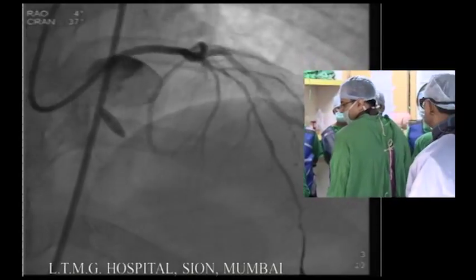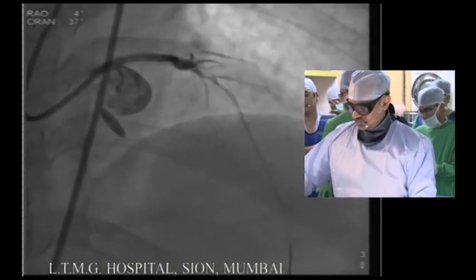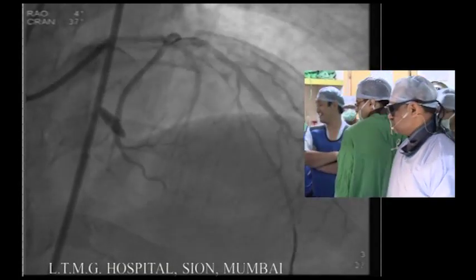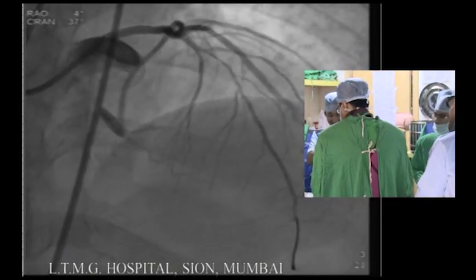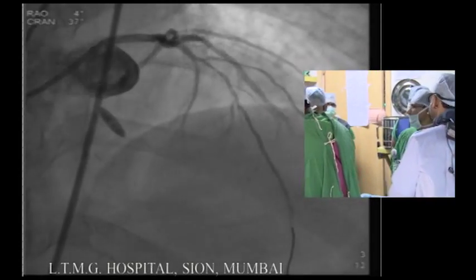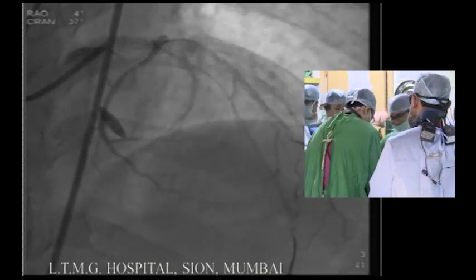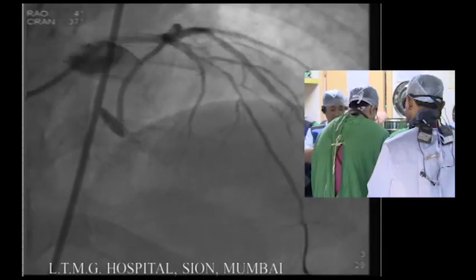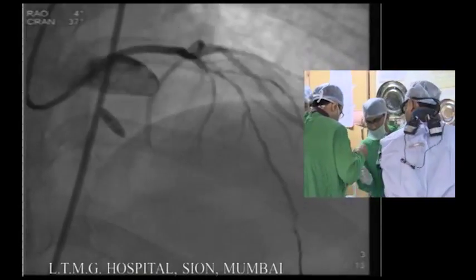Dr. Hamadaki, will you do IVUS first or balloon first? In Japan, of course, we do IVUS first. But after ballooning is also one option, as we have heard in the lecture, though in our daily practice we use IVUS first.